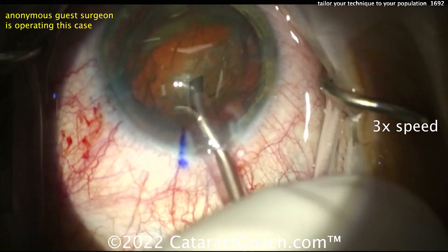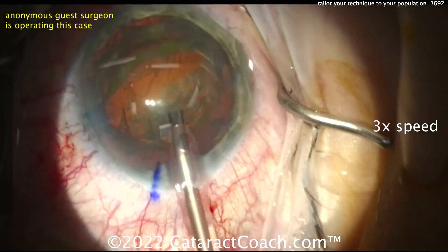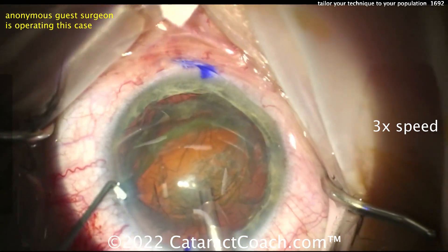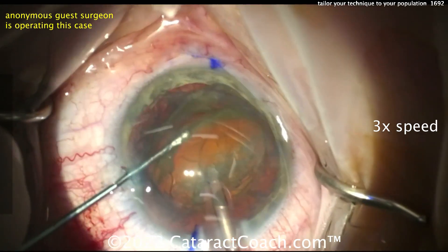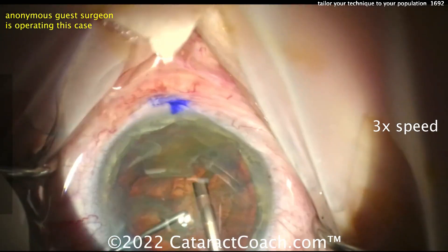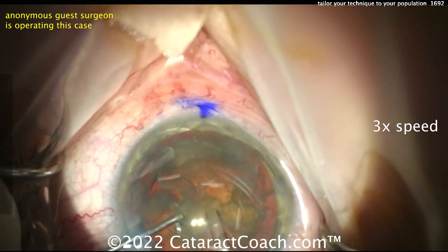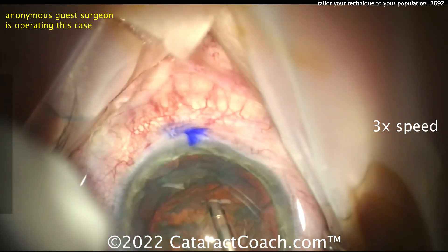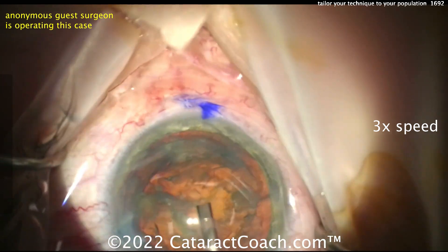The FACO probe is going inside the eye, and the chopper is going inside as well — going around the back. Very nice. So this is the flip and chop technique, which is a very appropriate technique for your average 2 to maybe 3-plus nucleus density cataract.